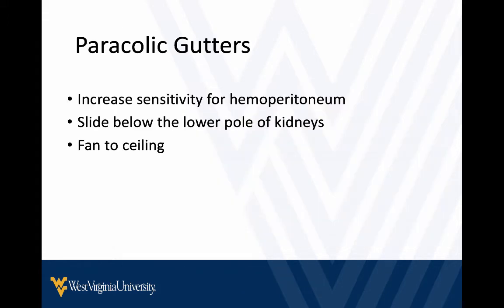So as I alluded to, we should be looking in the paracolic gutter for any patient where we're worried about intra-abdominal bleeding, and really what you do is just slide below the kidneys, fan to the ceiling, and you should be there.